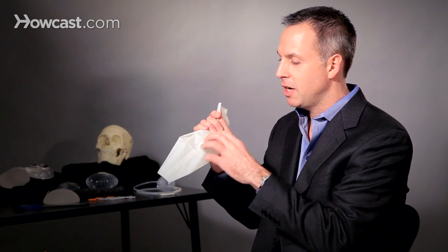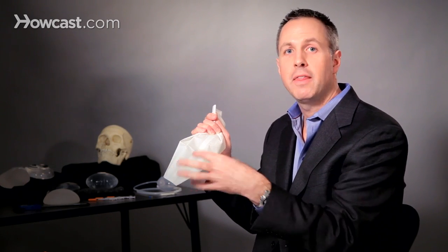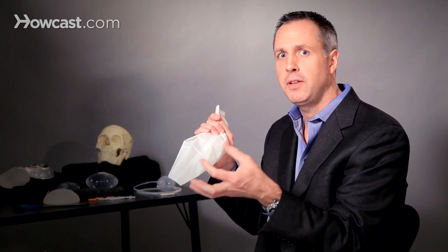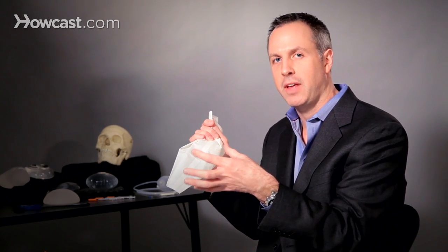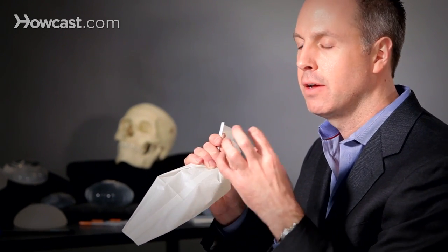The implant never touches the breast skin, therefore it never has an opportunity to be contaminated with any bacteria that may still be on the skin. In addition, the implant is not traumatized and the implant is placed within the pocket in a very fast and efficient manner.